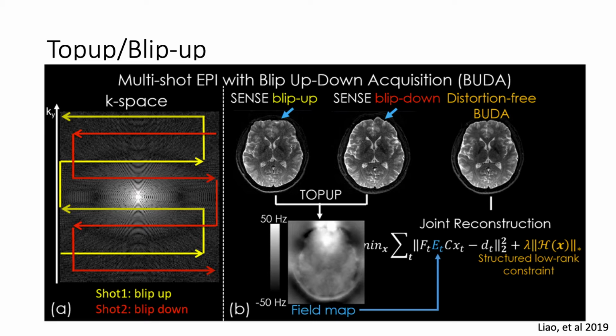Some are going to be faster than others, some are going to be more robust to alternative sources of noise, like motion, for example. So you have to apply it knowing your data set going into it. Okay, this is the approach I'm going to use, test it out and see if it fixes it or not, and then you might have to tweak it a little bit, and that's the name of the game with this.